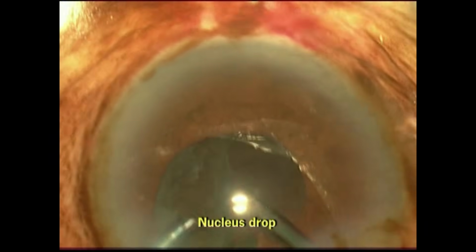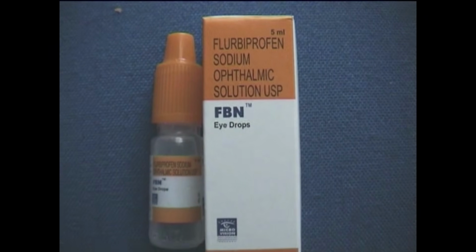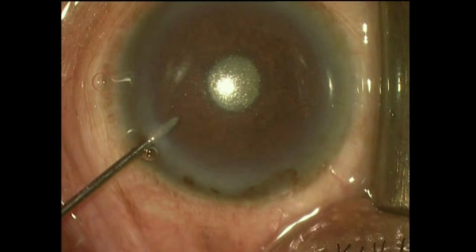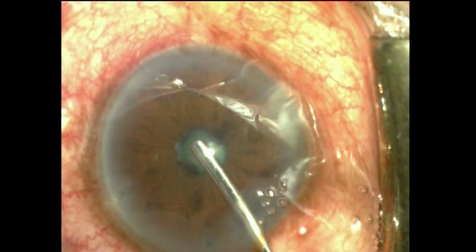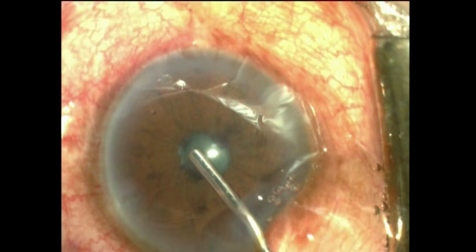Many techniques of pupil expansion can be used during cataract surgery. Pharmacological agents such as a combination of tropicamide and phenylephrine, preoperative use of NSAIDs, and intracameral injection of mydriatic agents can be used to dilate the pupil. Viscomydriasis involves the use of high viscosity OVDs such as Healon 5 to dilate the pupil.